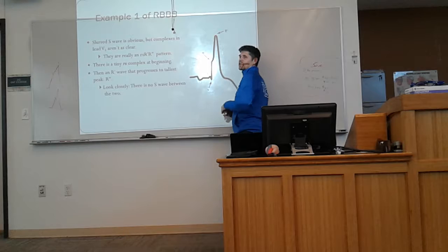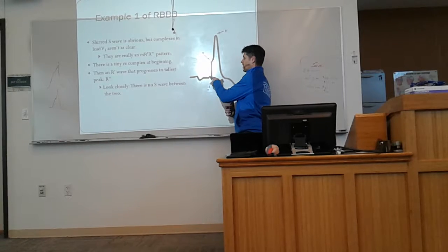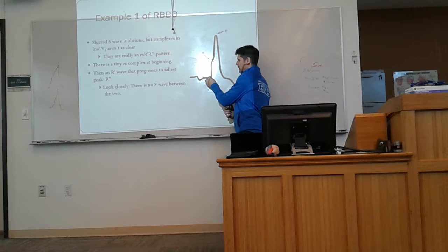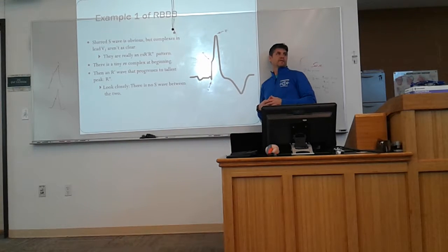Second of all, it would take more time. And if it were tucked into the QRS, like for example, a junctional rhythm, then I wouldn't be able to see the peak on it. It would be mixed into the QRS because it can't finish in that much time. It has to take more time than that, because the P wave does take more time than that. Would the P wave in a junctional rhythm in V1 be positive? Yeah, a lot of times it is.